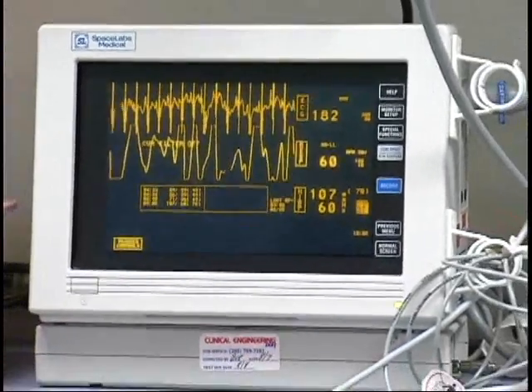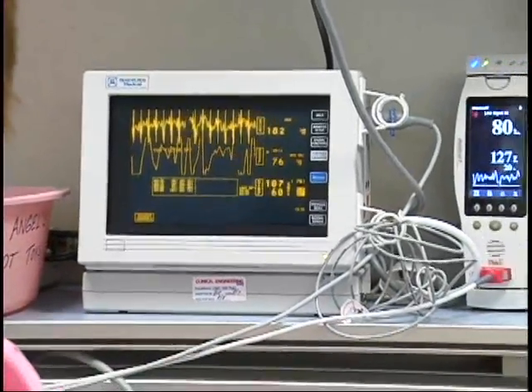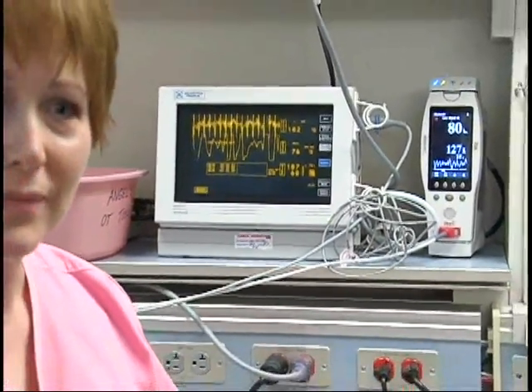Of course, don't be afraid of the numbers and don't focus too much on the numbers, because when the babies move around, like our babies do right now, you may get some false alarms, you may get a lot of interference in the numbers. What we tell our parents usually is if the nurses are looking at the monitor and just silencing it and not doing anything with your baby, then it's probably just a motion detector going off. If the nurse is actually moving and intervening with your baby, then maybe something's going on.